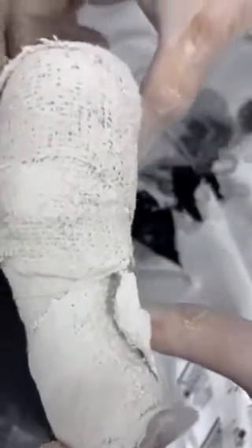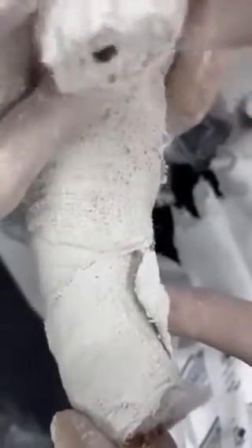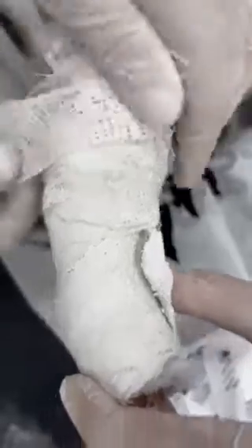Sometimes if the kid is fighting me, I will use a couple of back slabs on the knee, just to be sure without having excess cast material at the back.